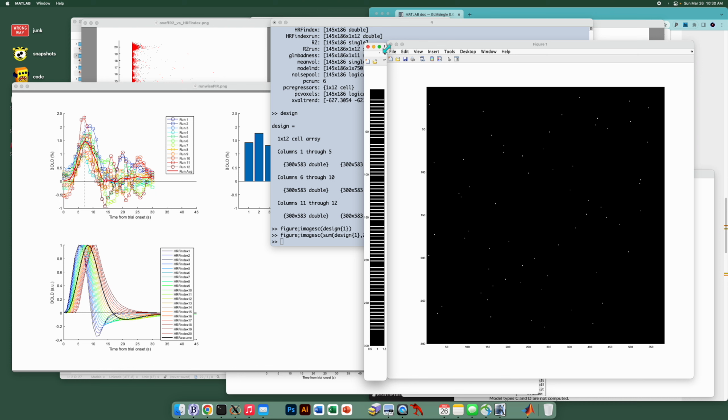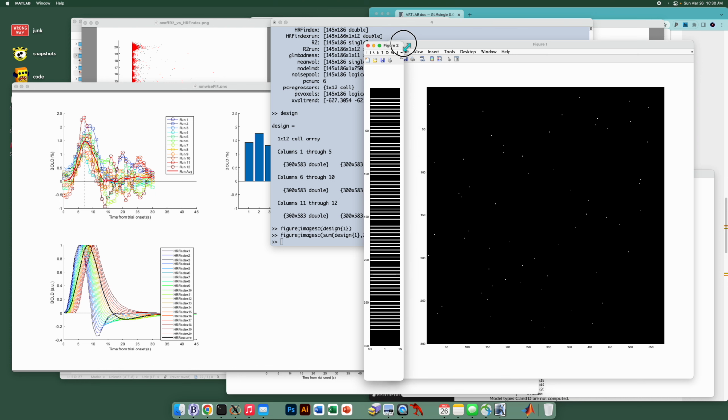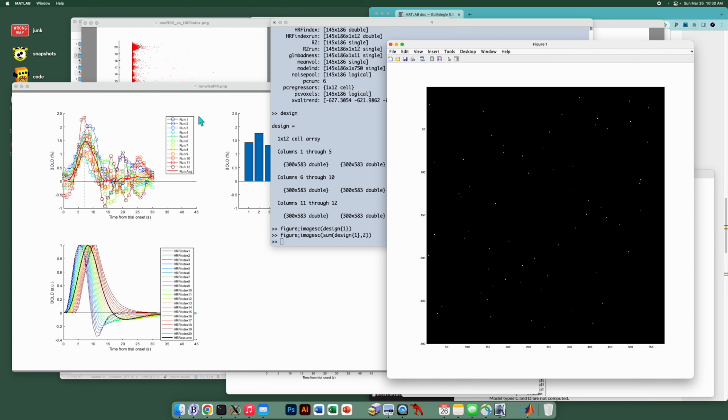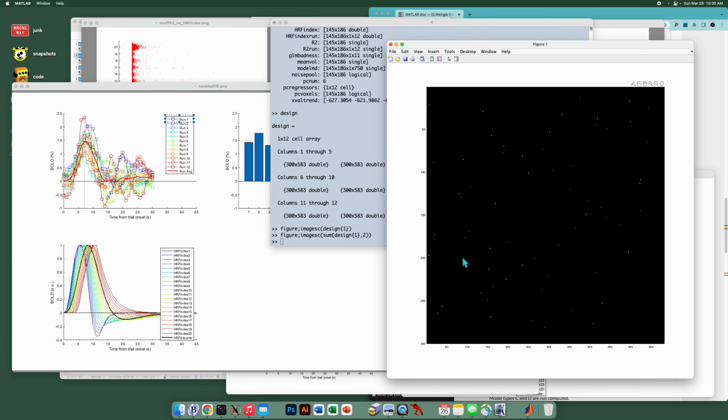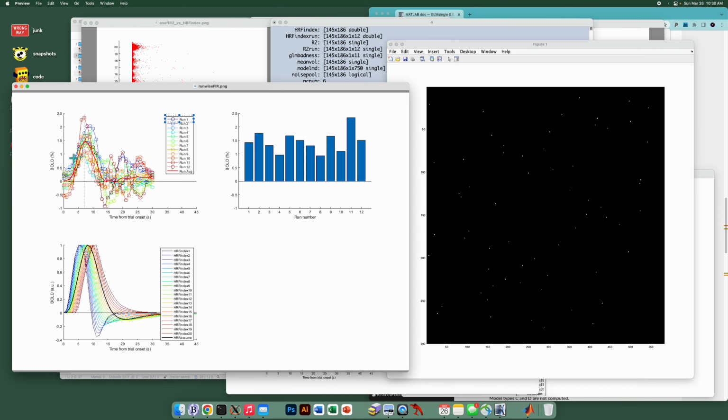Now, of course, this isn't really true for most interesting experiments, but for the purposes of fitting this FIR model, we're going to make that assumption. Okay, so in this very first analysis, we take each run of data separately and construct the single predictor on-off model, and then we expand that using finite impulse response basis functions. So you essentially have a different predictor for every time point in the response. And the default is to estimate this up to 30 seconds post trial onset.